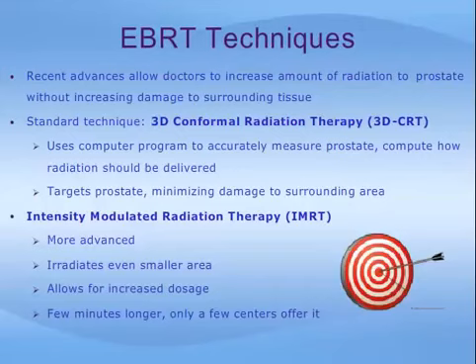Intensity modulated radiation therapy, or IMRT, is a more advanced technique, which has sharper dose fall-off around the prostate target and allows for an increase in dosage while aiming to keep the side effects to a minimum. Each IMRT treatment is a few minutes longer than 3D CRT, and it is not available everywhere, but more and more centers are offering this treatment. While being more technologically involved, it is not yet proven to be better than other more widely used techniques.